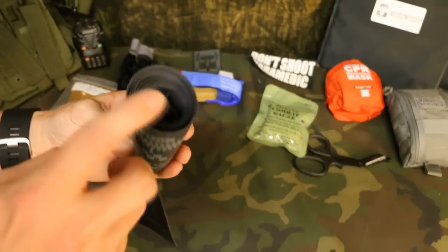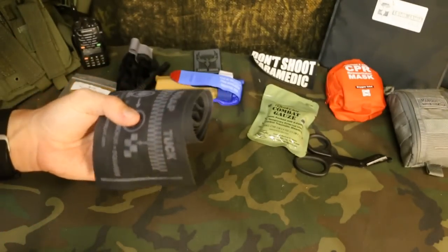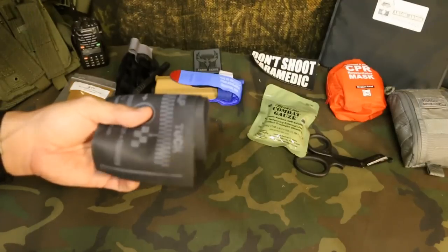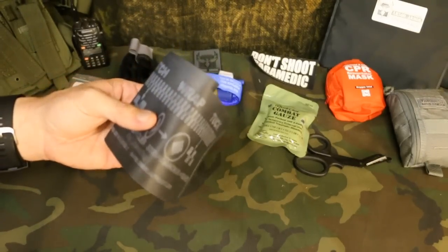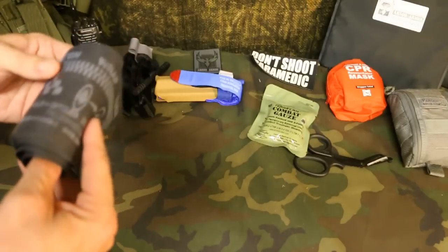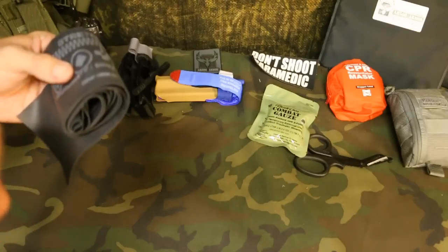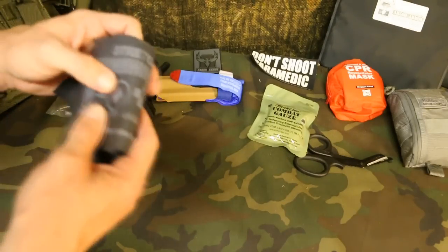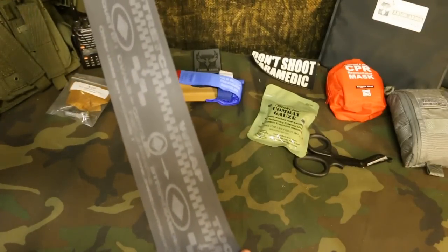When you open up your SWAT-T tourniquet, inside it does come with a band that goes on the wrist. It has vital signs, time, blood type — things like that — to write on there as well. It's a bracelet that you can write on. You obviously wouldn't want to delay transport or further treatment to write on it, but it's there to help you keep track of time and vital signs after applying the SWAT-T tourniquet.